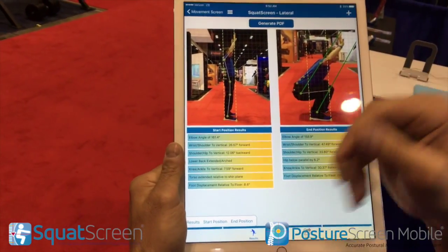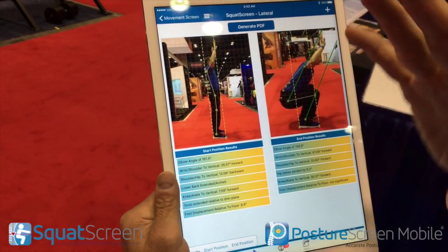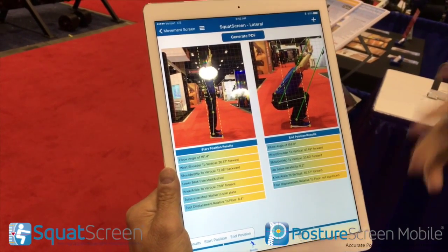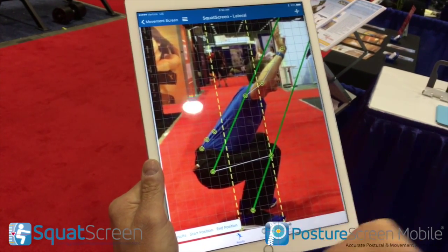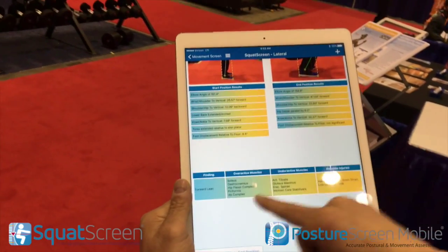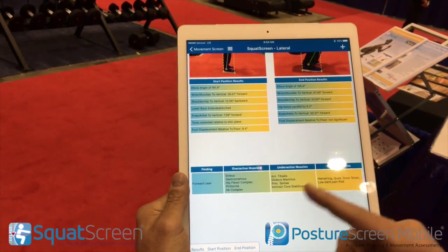Capturing all this data means that when we do a follow-up exam with that person, you'll be able to show what's happened before and after your treatment or training. But here's the special sauce within movement screen: linked to the overactive muscles, underactive muscles, and the possible injuries.